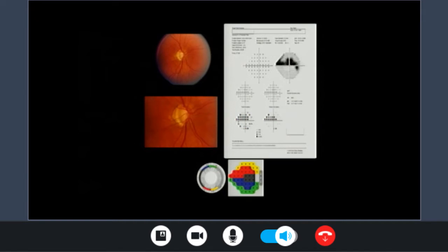Would it tell you something? 20%, would it tell you something? No, false negative. What does it tell you? Or look at the eye gaze tracker here. Exactly. So the patient is not paying much attention to the test. Okay? Sometimes he's disturbed. So you can actually look at the gaze tracker here and it will give you some information about the patient's performance. So when we look at the reliability indices, it's normal, it's fine for us.